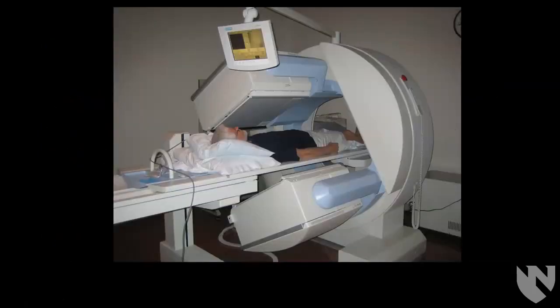To start off, this is what a gamma camera looks like in the nuclear medicine department. Usually you have two cameras, which you can have either immediately opposite each other or at a 90-degree angle to each other. Within all of those, you have all the parts: the collimator, then the scintillator crystal behind that, and then the photomultiplier tubes and all the digital circuitry behind that. Usually they're mounted on a gantry that can rotate around the patient so you can get images from any angle.